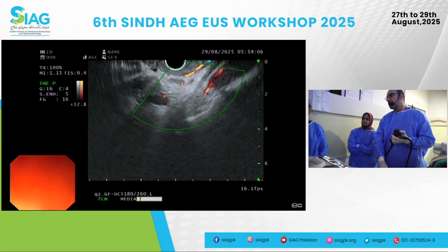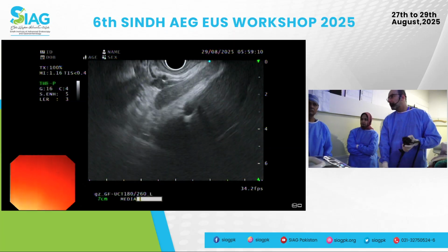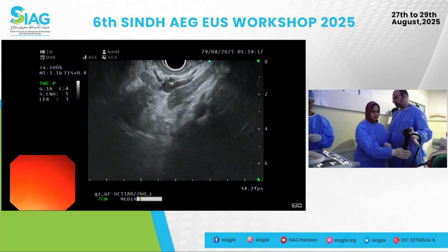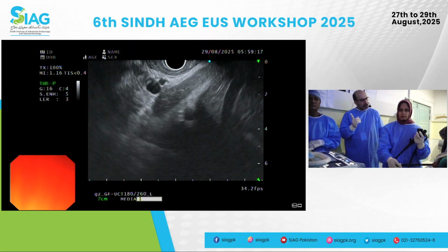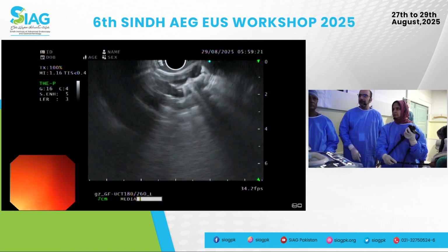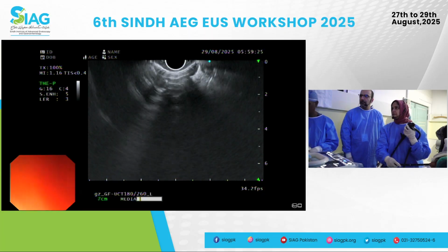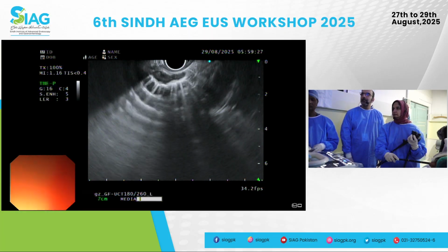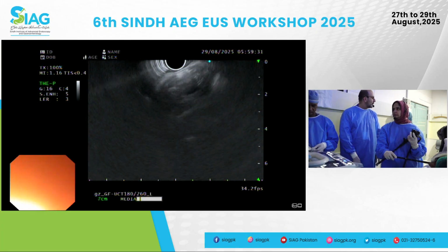Thank you, Dr. Mustafa. Okay. So we will be taking over. You want to do the stage to the mediastinum? Nadeem is giving a talk on rectal EUS. Oh, you want to go to that? I'll just do a quick sweep through the mediastinum. Sorry, he's giving a talk on rectal EUS. My bad. Good texting.